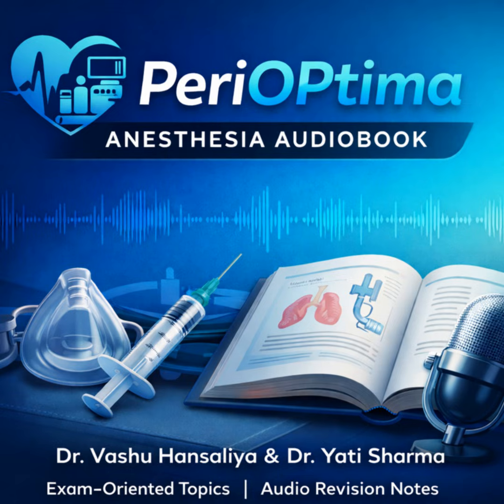And what about the seal? You've got this high-pressure connection. It needs to be airtight. That's where the Bodok seal comes in. Okay. Its conceptual safety role is crucial. It's a non-flammable, deformable washer that maintains an airtight, high-pressure seal between that cylinder valve and the yoke. And for the exam, you need to know what happens if it fails.